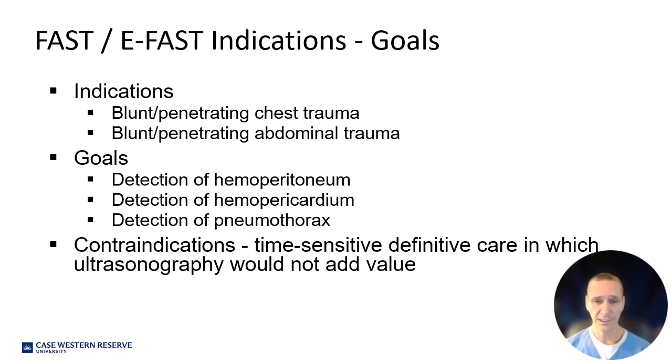And really the only contraindication is you don't want to delay time-sensitive care because you're doing the ultrasound and FAST exam. For example, when I'm flying, if I have a patient who's clearly bleeding, who clearly needs the operating room, doing the FAST exam and delaying care is not necessarily the best thing to do.